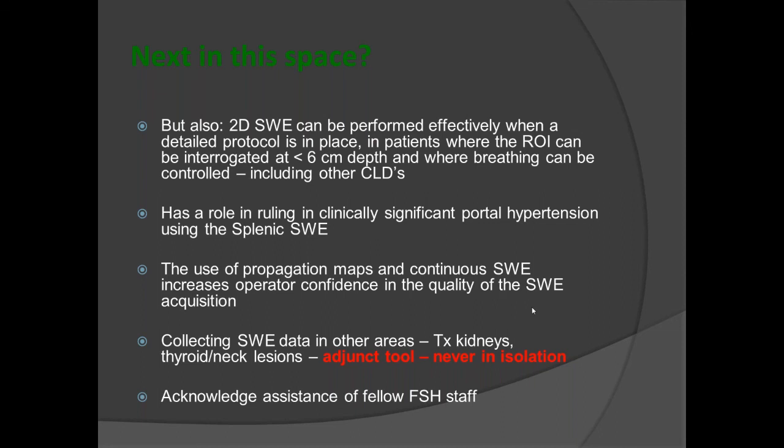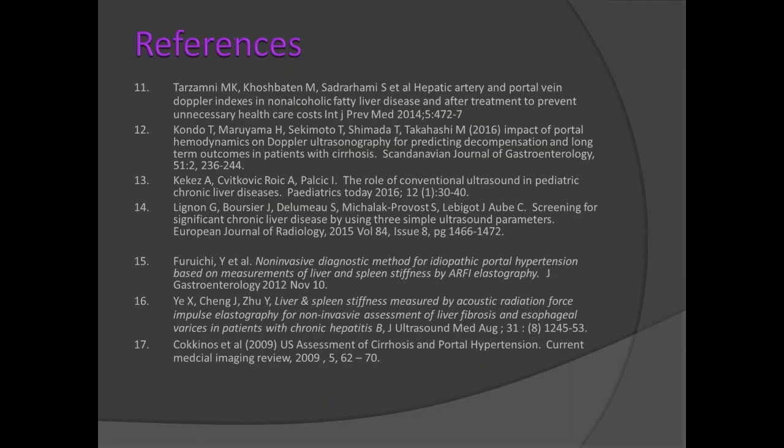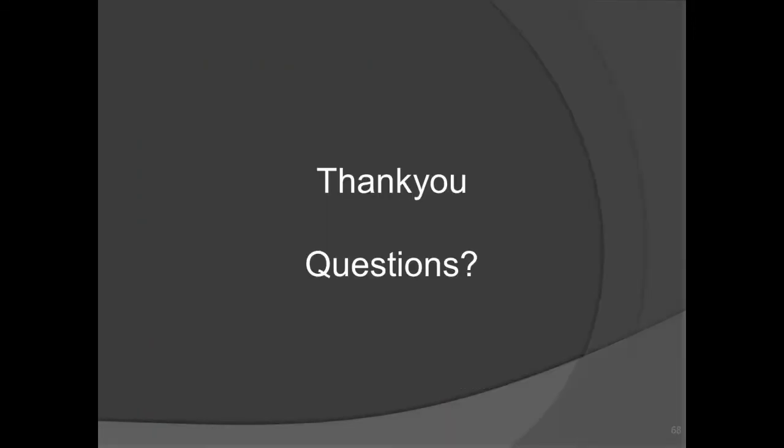Can you put the reference slide back up, please? I believe we're probably referring to the chart of values. Would that be correct? Oh, Amanda, do you just want references?